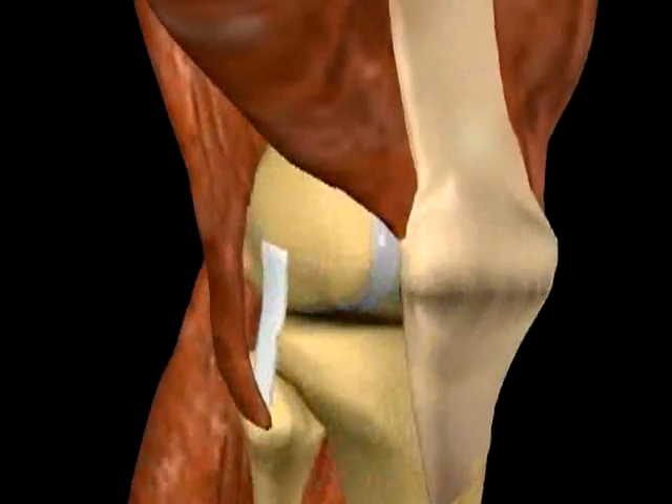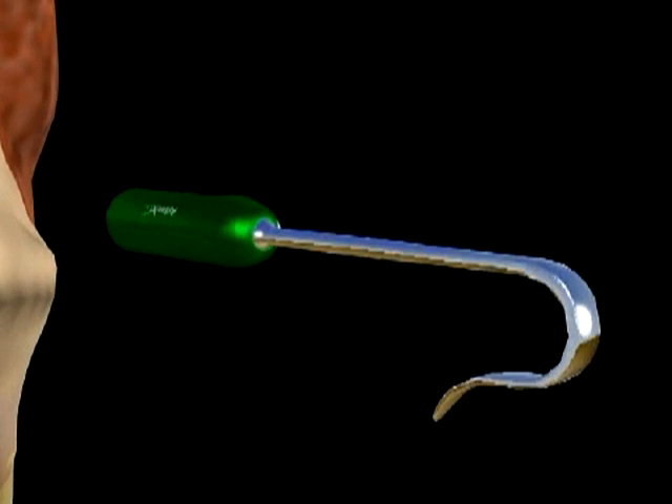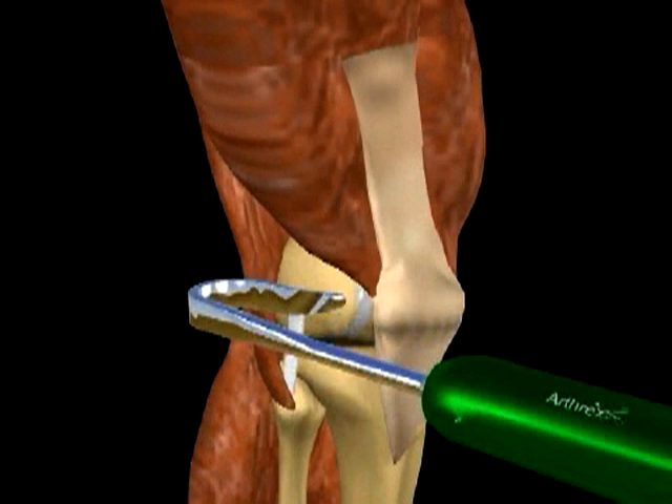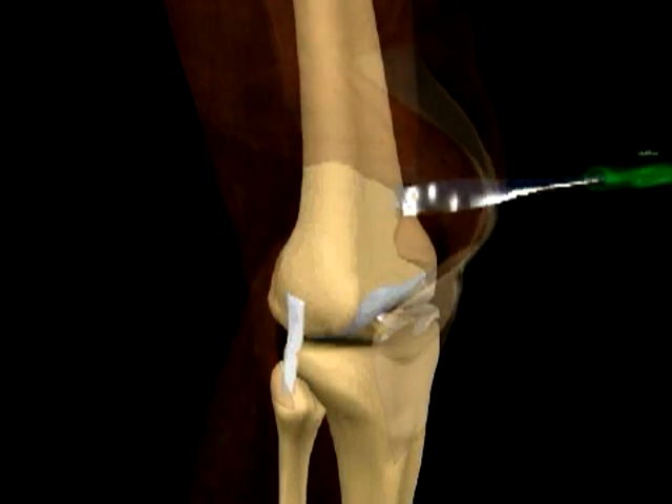With the patient in a supine position, a 4-6 cm incision is made over the distal lateral aspect of the thigh. The iliotibial band is split longitudinally and further blunt dissection is carried out to expose the lateral metaphyseal and diaphyseal flare of the lateral femur. The Arthrex Quadriceps Tendon Retractor is used to protect the vastus lateralis and thigh musculature throughout the procedure. An additional retractor is placed posterior to the femur to protect the neurovascular supply.